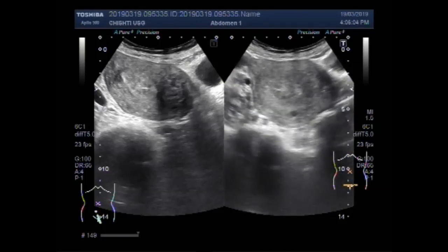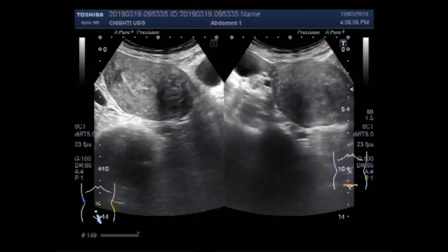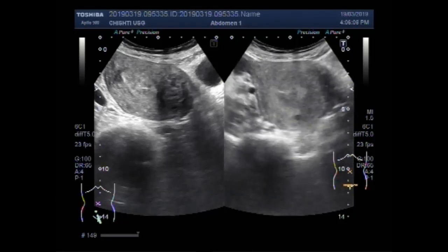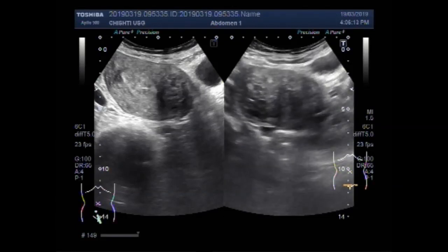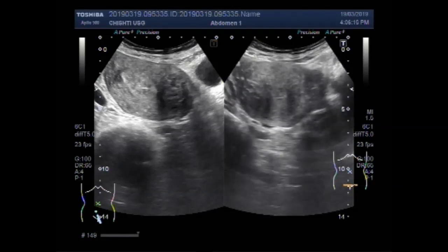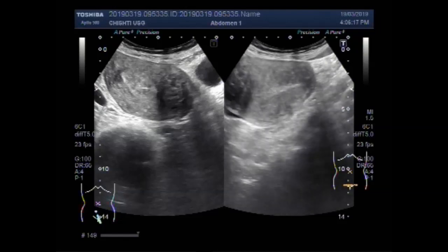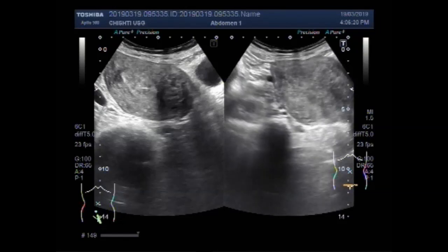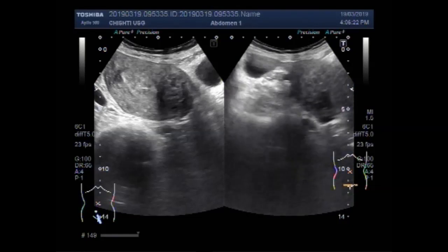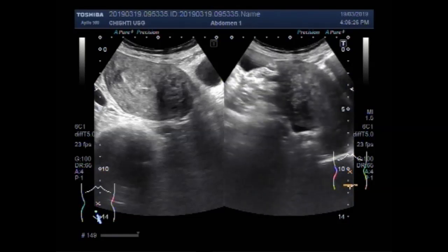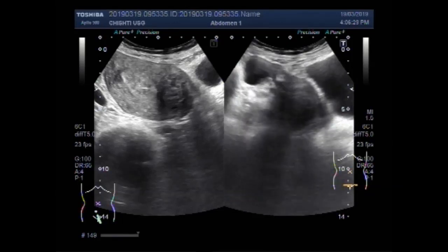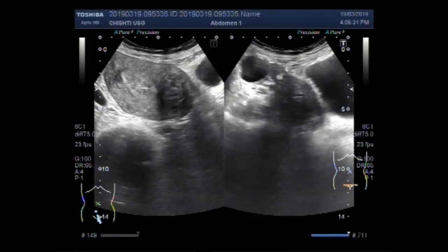Now you are going to see another finding in the ovary — an ovarian cyst. Along with the two findings already shown, in the upper left of this picture you can see the left ovarian cyst.